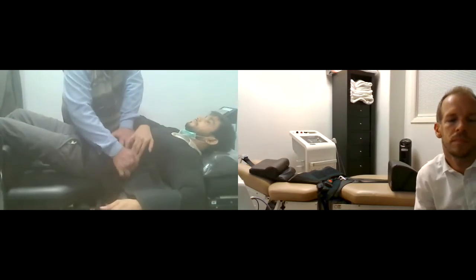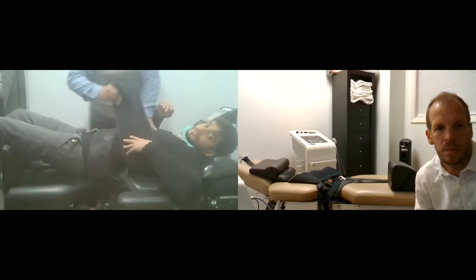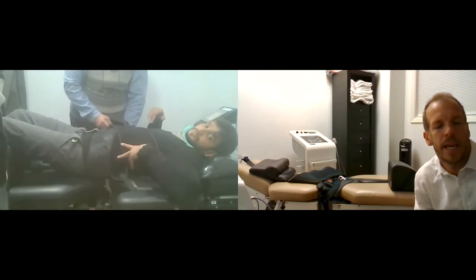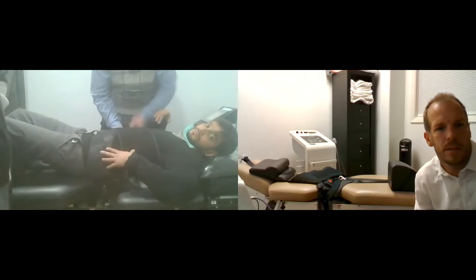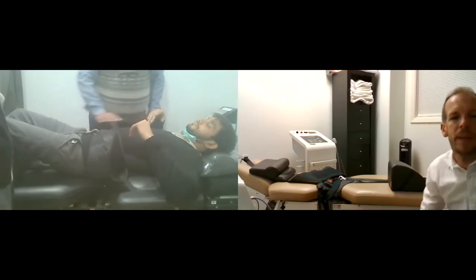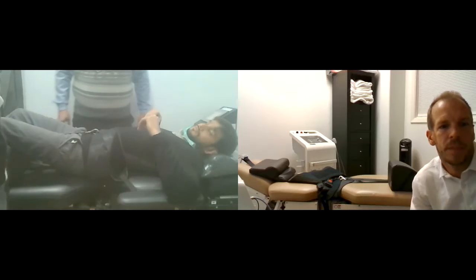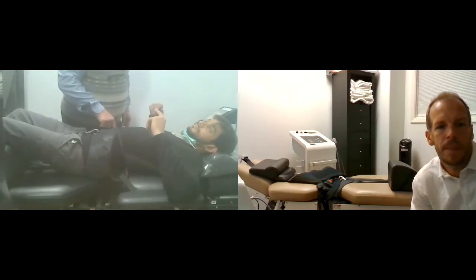See? Maybe, yeah, down just a little bit, maybe. Yes. Yeah, that looks good. Now, come across and make an X. Yeah, it's making an X, okay? Yeah.